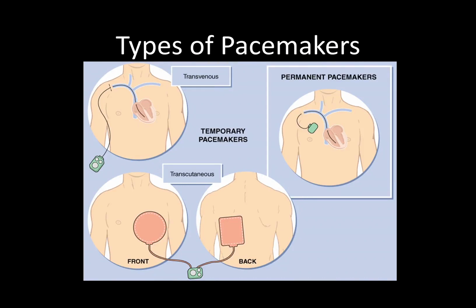The more common types of pacemakers we run into can be divided into two categories. You have the permanent pacemakers, which is what most people think about when you hear one. Grandma or grandpa's got a pacemaker now. These are ones that are actually implanted. It goes underneath the skin, and the wire, as you can see here, actually goes through the subclavian vein, superior vena cava, and terminates inside the right ventricle. And that's the most simple and pretty much most common version that we talk about when a person gets a pacemaker. It gets more complicated from there, but we'll just start with this for now.